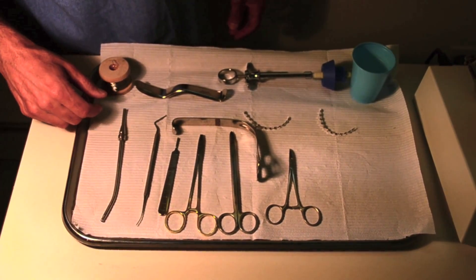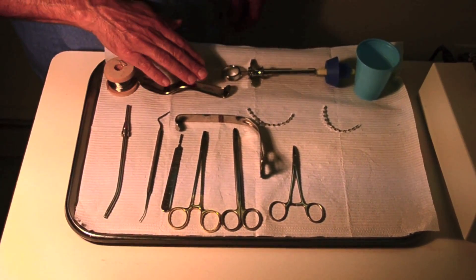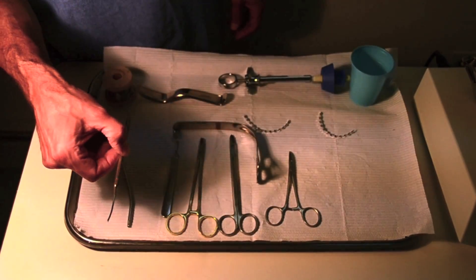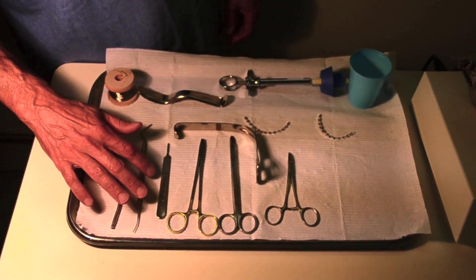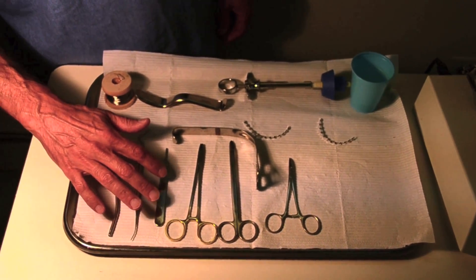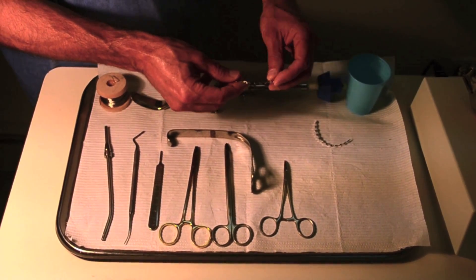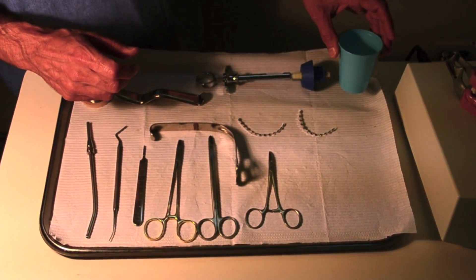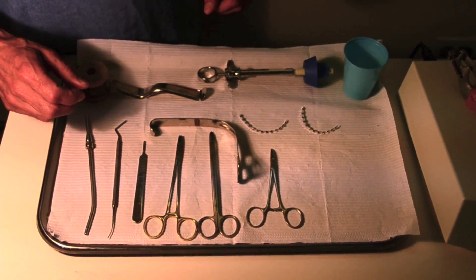Here's the typical equipment setup I would use to place arch bars: 26 gauge stainless steel wire, a Minnesota retractor and a sweetheart tongue retractor, a gauze director to hold the wire down beneath the cingulums of the anterior teeth, a bar parker handle with a scale for measurement, a wire twister, wire cutter, mosquito hemostat, the Erich arch bars themselves, and a container for your wires. The cut wires are considered sharps, so handle them carefully to avoid injuring anyone in the surgical field.